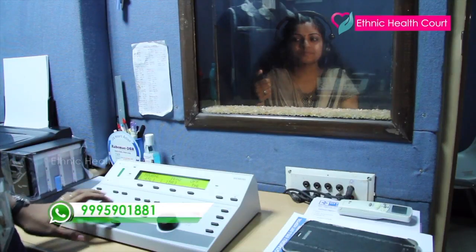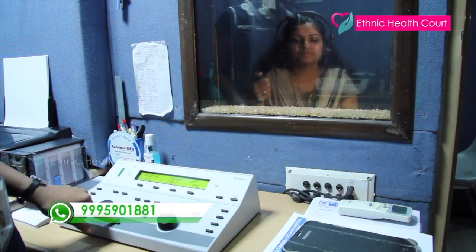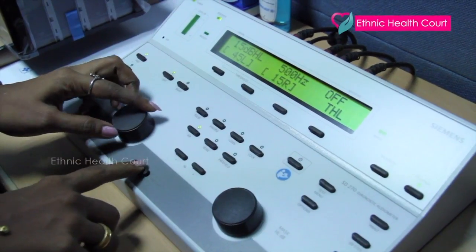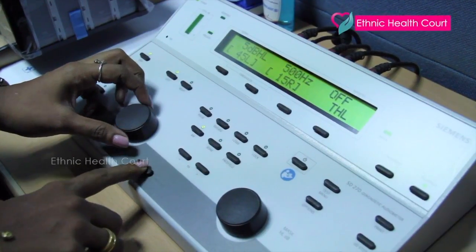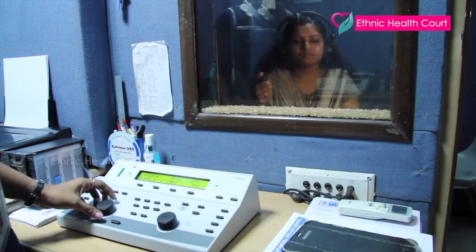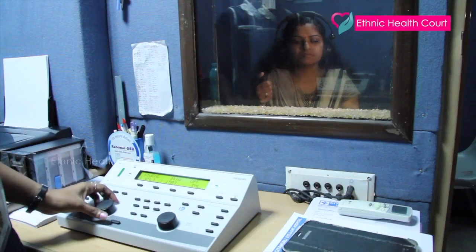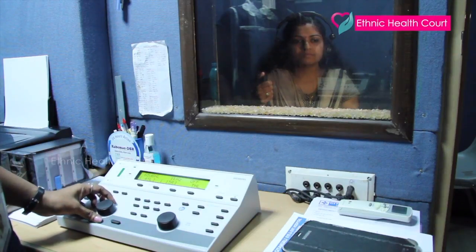If you ask the patient, you can respond to their response. If a patient responds by hand, you can record that answer. We can note the sounds and plot the responses. If you plot the report, it's called an audiogram.